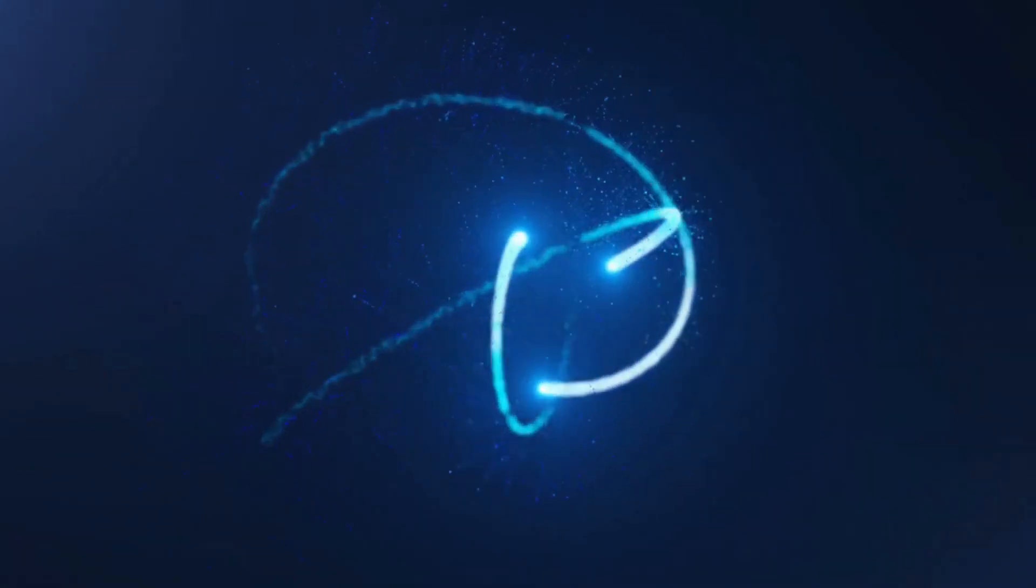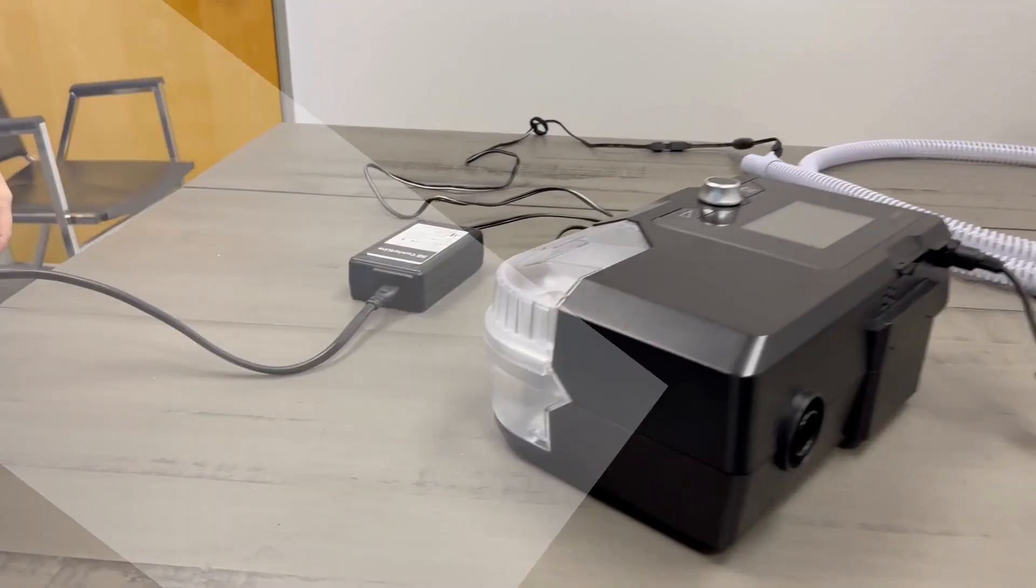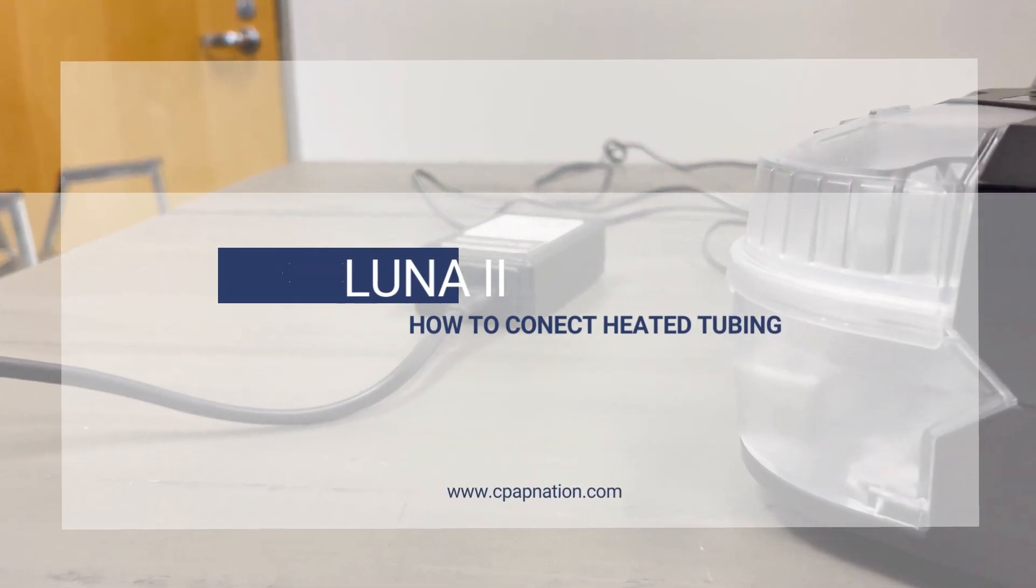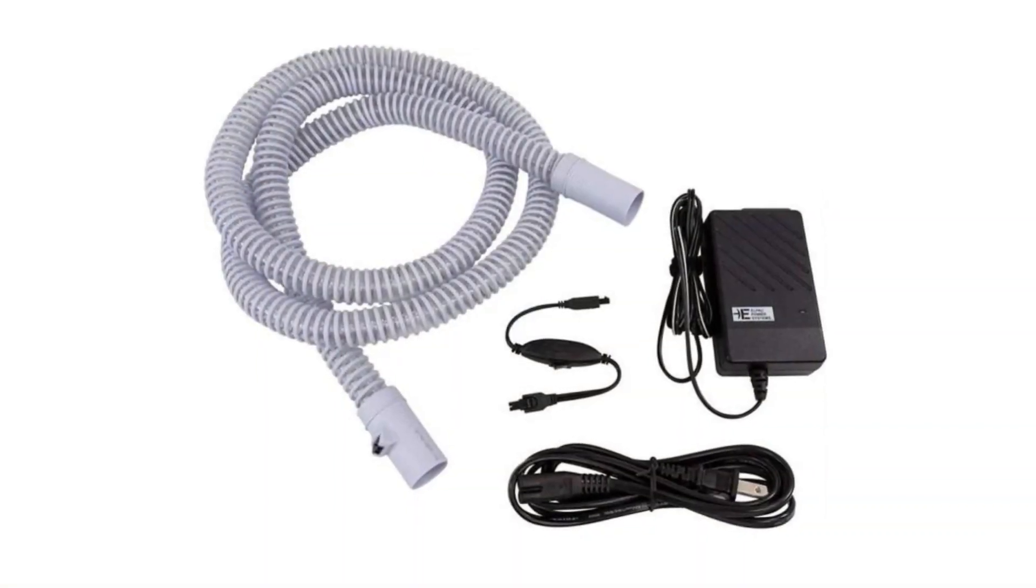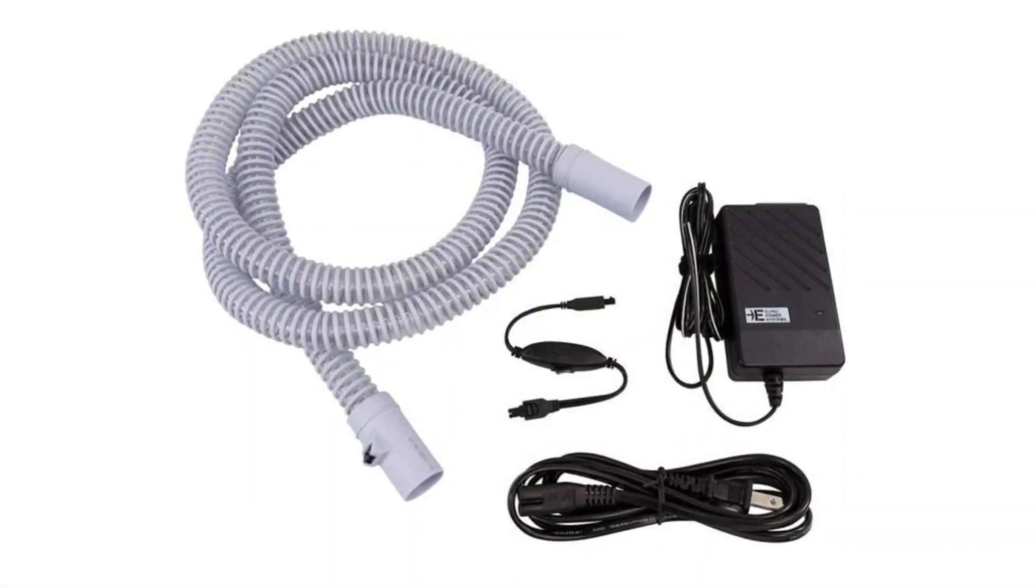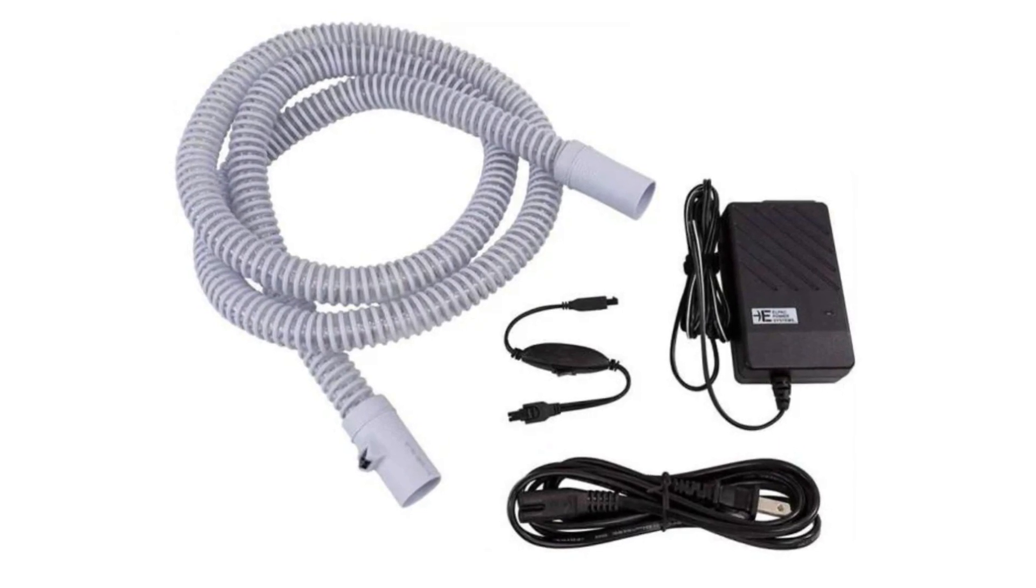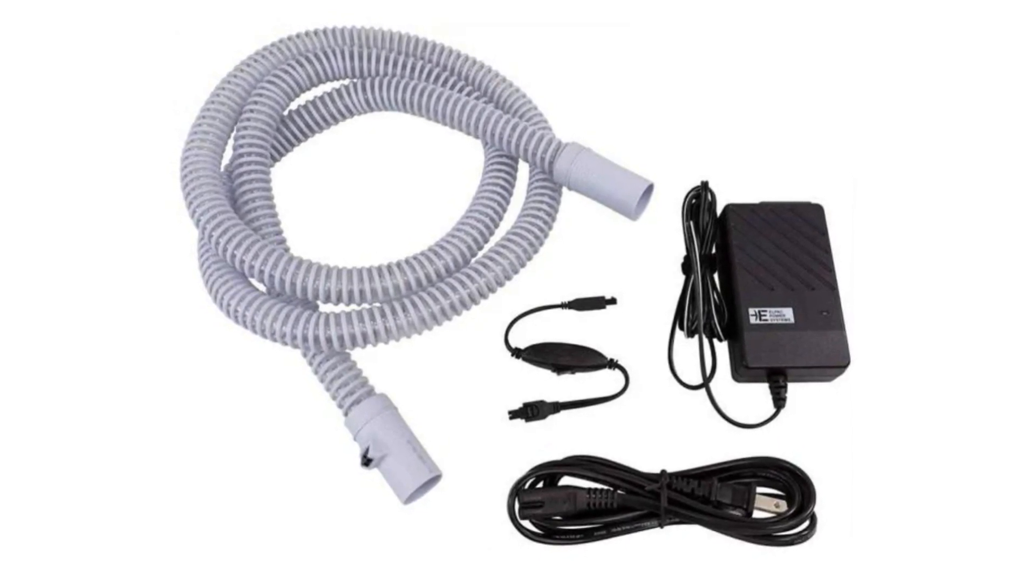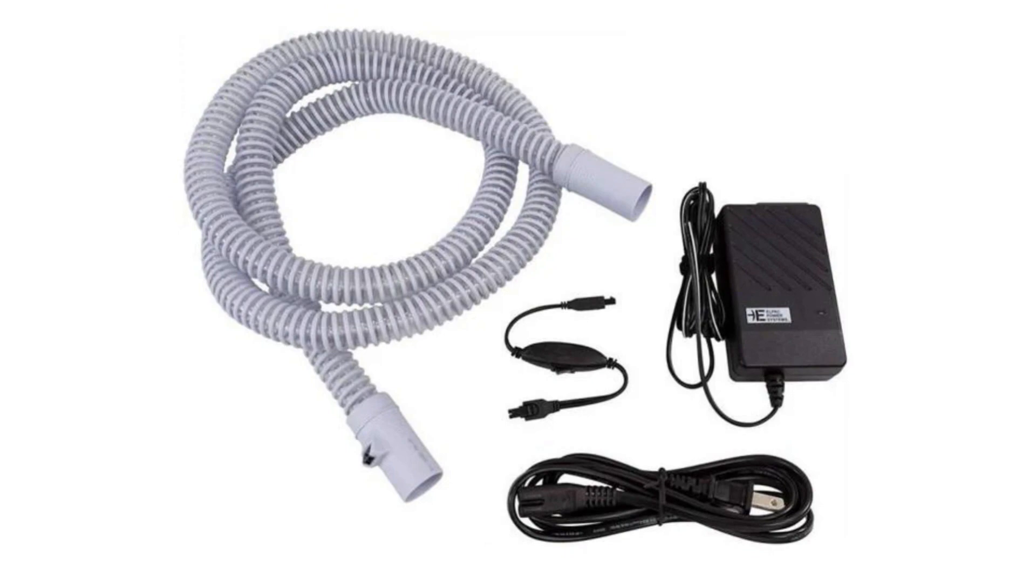Let's get you familiar with your 3B Luna 2 Auto CPAP heated tubing. When you take it out of the package, you will find that it includes the tube itself, the heated tubing power adapter, power cord, and power source.